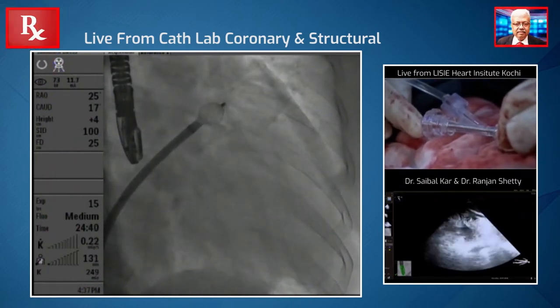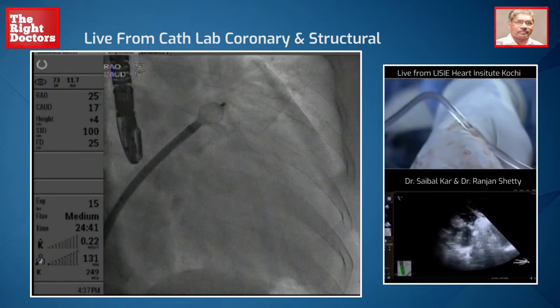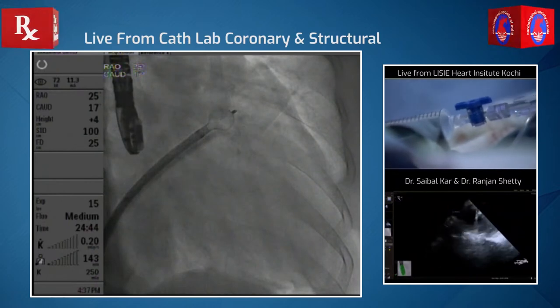Can I see my echo now? Can you show me the echo ball? So that's at the level of the circumflex. We need to see a little more clear echo — we need to see the appendage. So we're going to follow by echo — it looks quite good.